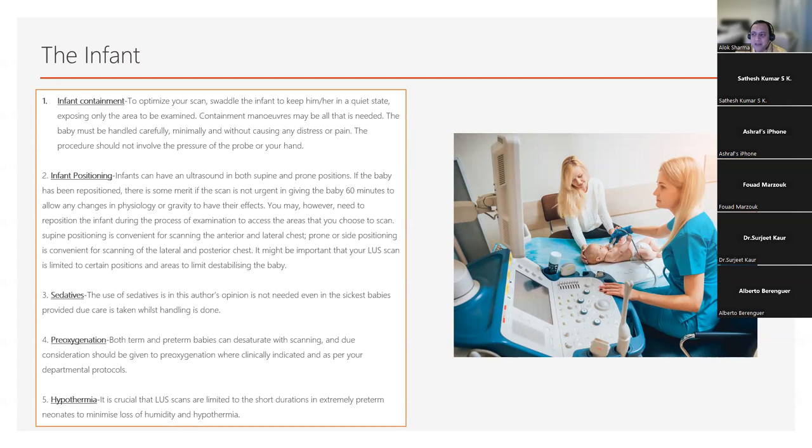And you might have to actually think of not just a pneumothorax, maybe another dose of surfactant because RDS is progressing, but it may well be that there is a problem with PPHN, which then needs you to diagnose using heart-lung interaction and being able to perform an echo. So it's really important for us to standardize this approach to decide what is the clinical context in which we're using lung ultrasound in our unit.